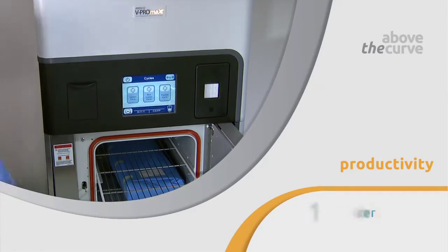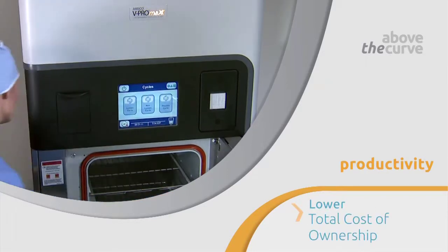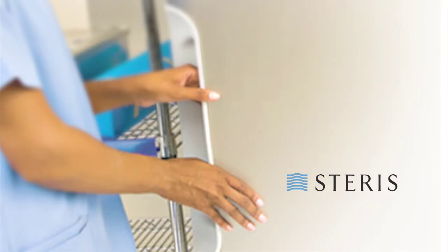One sterilizer with three cycles, designed to take your processing performance above the curve. AMSCO V-Pro Max low-temperature sterilization system — rise above the curve. For more information, contact your Steris account representative.